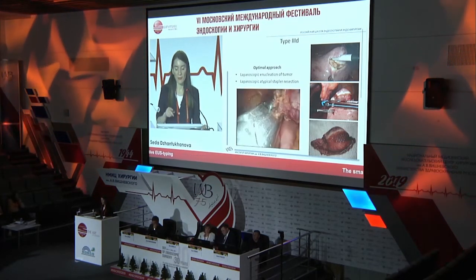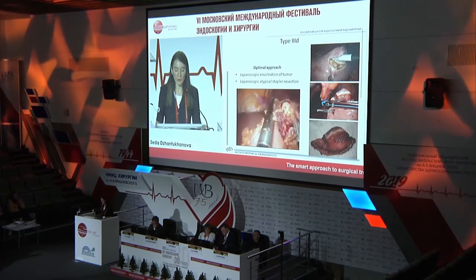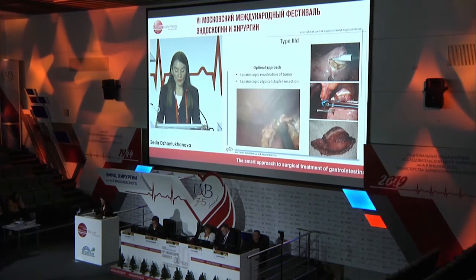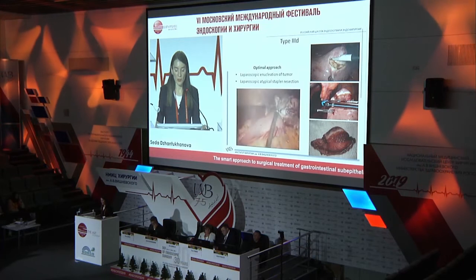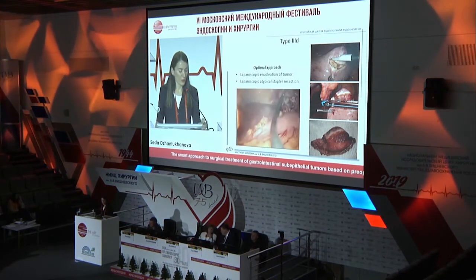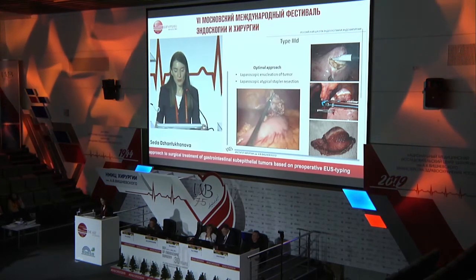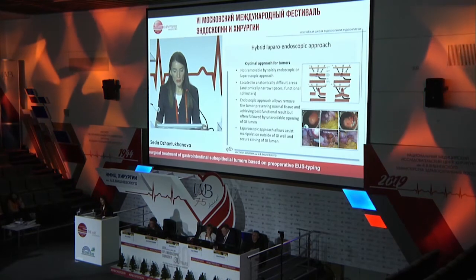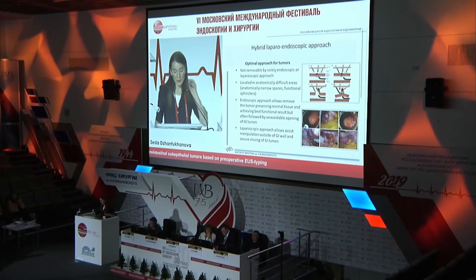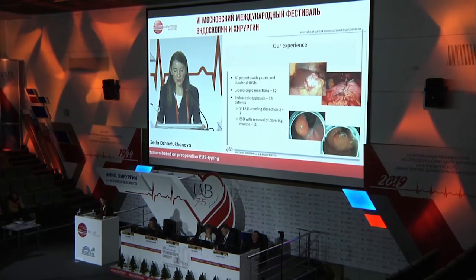As you can see here on the video, the growing point is really, really small, and just one stapler is used to remove this tumor completely. If you notice, this was a patient in which we used the single approach and curved instruments, only one port for this laparoscopic surgery. We sometimes use a hybrid laparoscopic approach. I will skip this; we'll talk about it on Thursday during the day on hybrid approaches.